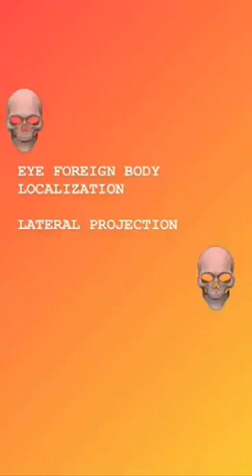Foreign body localization, lateral projection. A non-grid, very high resolution technique is recommended to reduce magnification and eliminate possible artifacts in or on the radiographic table and grid. The following steps are observed. With the patient either semi-prone or seated upright, place the outer canthus of the affected eye adjacent to and centered over the midpoint of the IR.